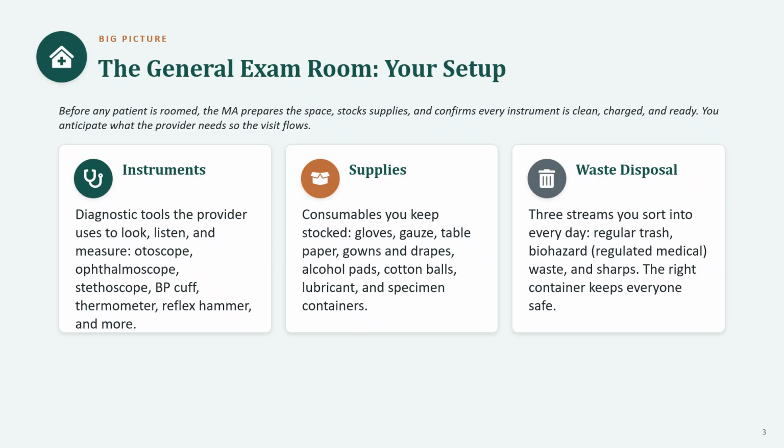A good MA thinks one step ahead. If you know the provider is doing an ear check, you make sure the otoscope has a fresh light and disposable specula are within reach before the patient is even roomed. Hold on to these three buckets because we will spend the rest of the lecture filling each one in.